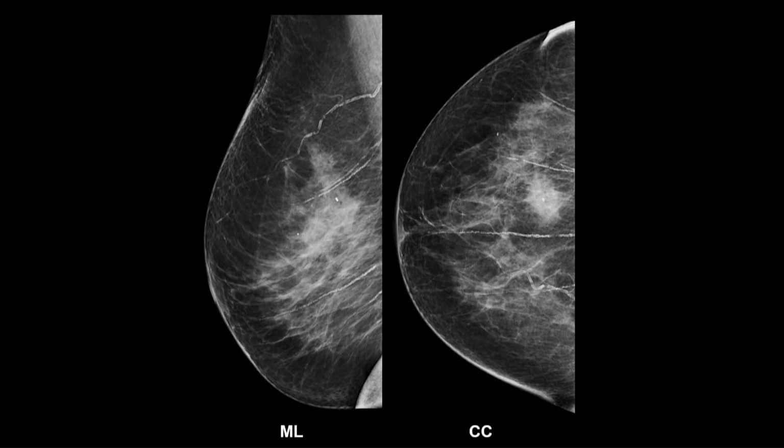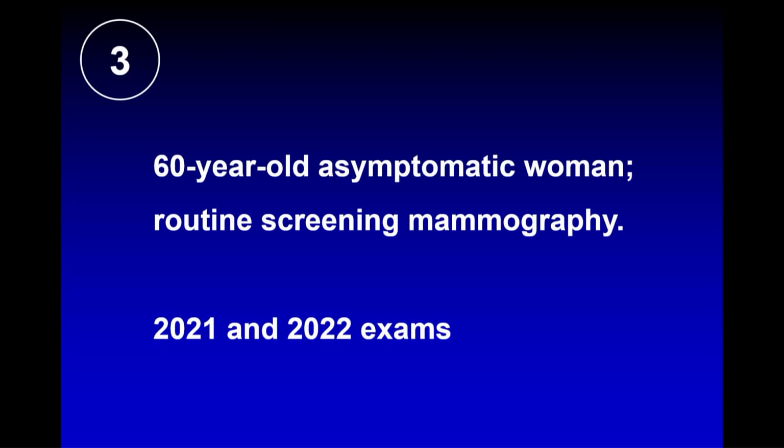Questions? Not seeing any, we move on to case 3. Asymptomatic woman.